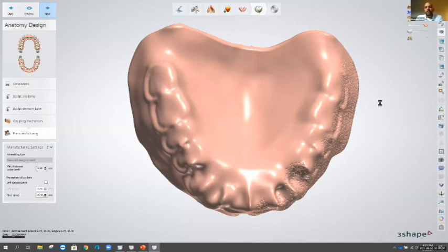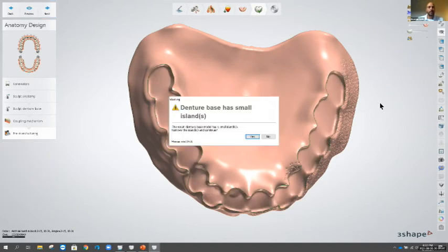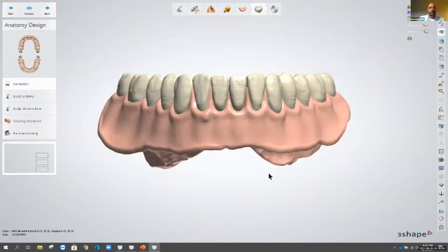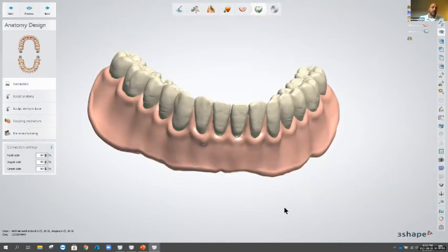So basically what it does is it extracts the patient's existing teeth, gives you gingiva sites. And what you'll do is you'll sculpt those gingiva sites into the size or the length that you want their new gingiva to be. Then you'll design the denture or the teeth that fit to that. So you can make a nice diagnostic wax up of that.